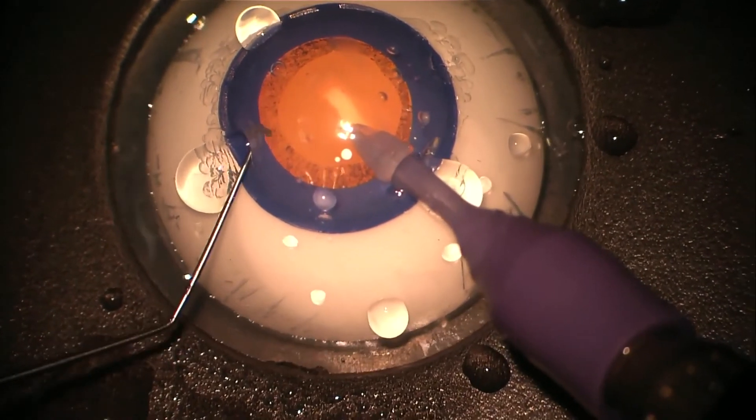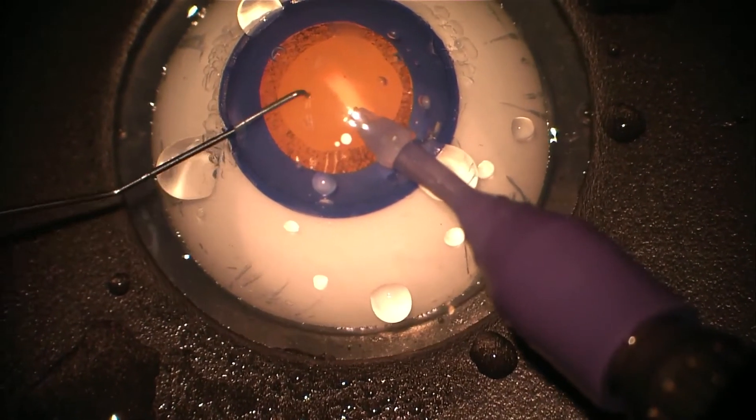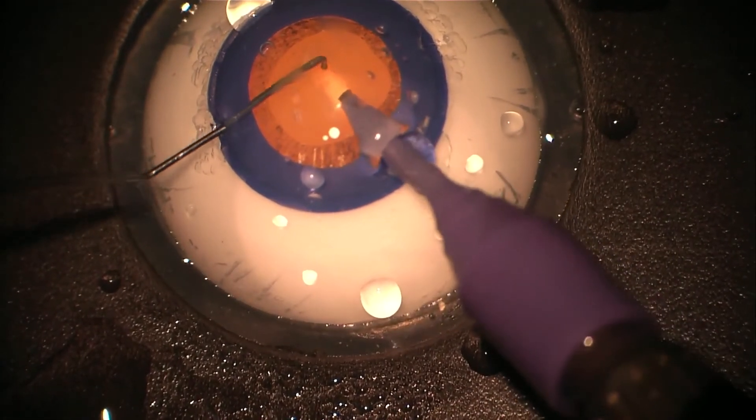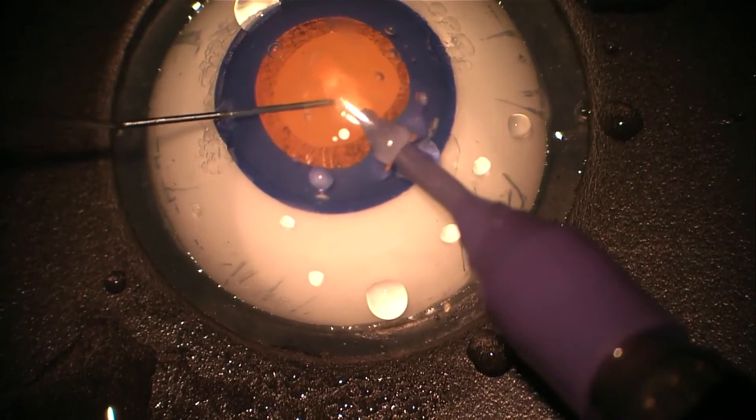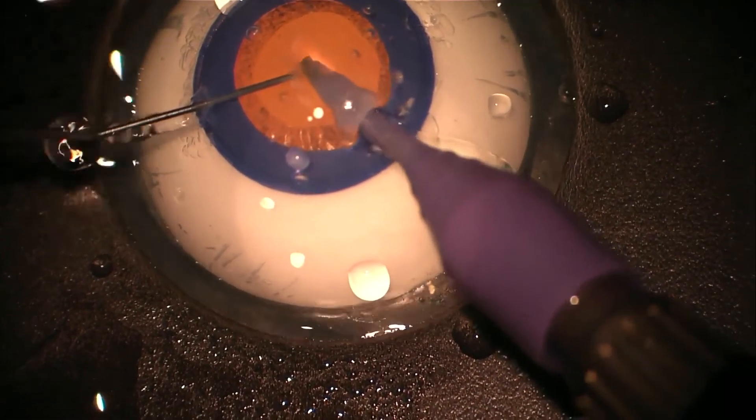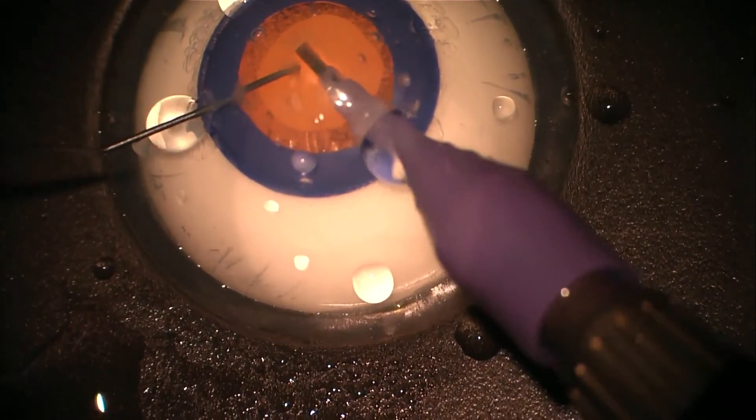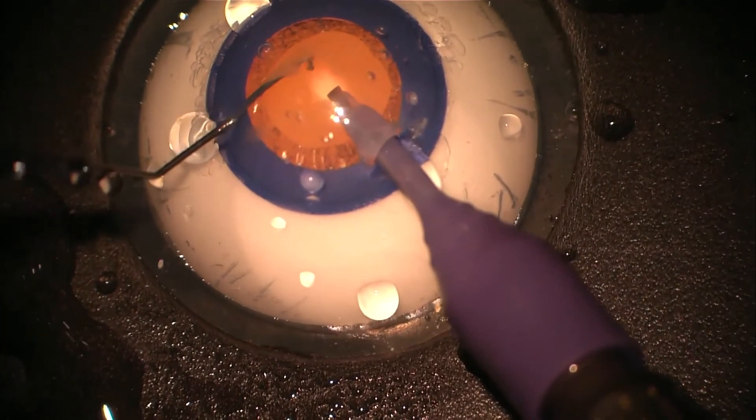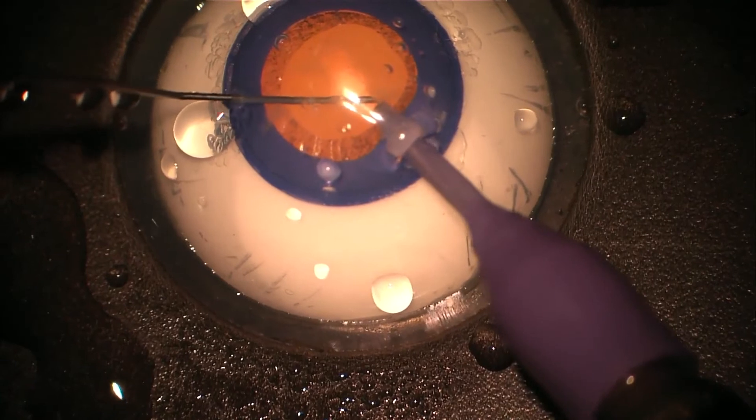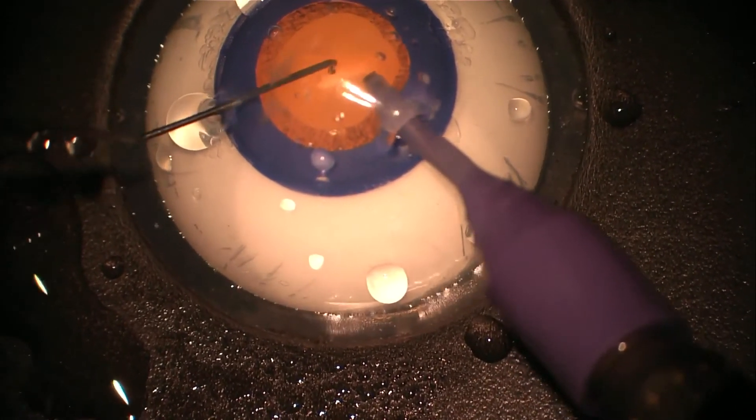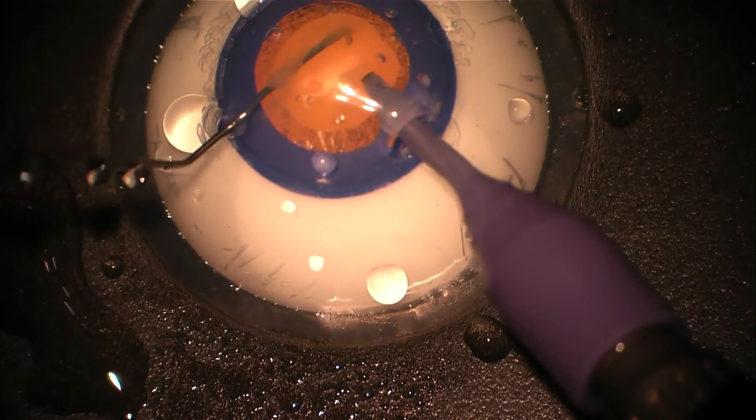Here we can see the second instrument being introduced via the side port and this is going to be used to rotate the nucleus. With the soft gel eyes the lens material is relatively soft and so the second instrument just slides into the lens material a little bit more than it would in a human eye. This is less of a problem with the harder basic faco eyes.